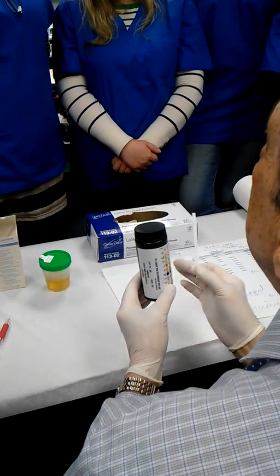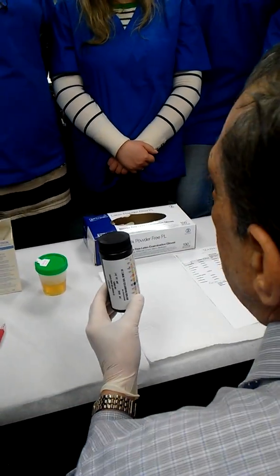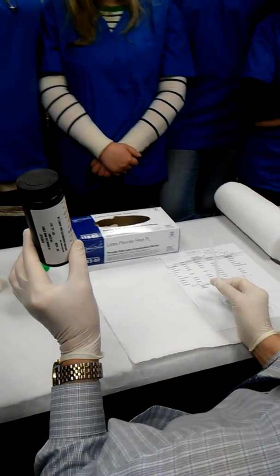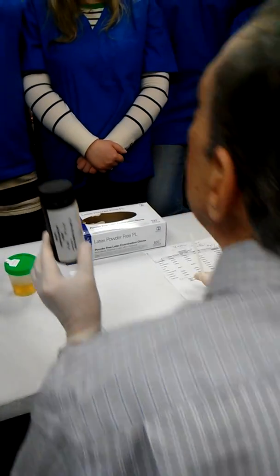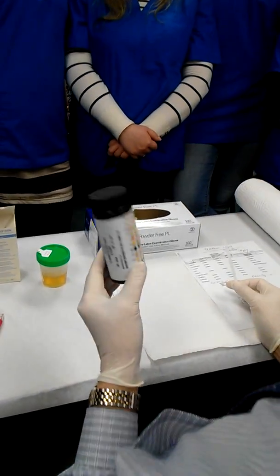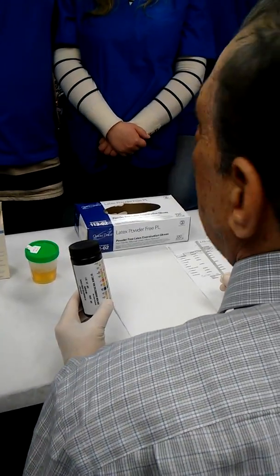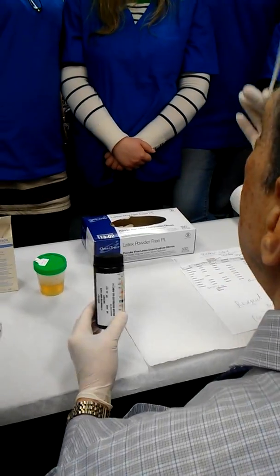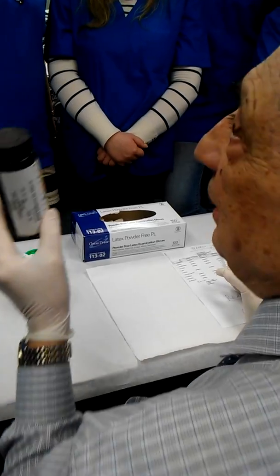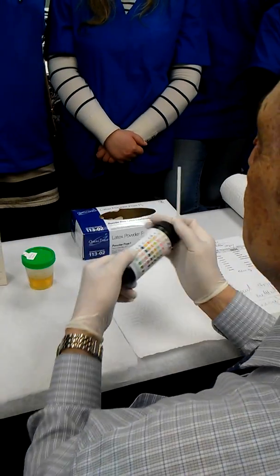For example, if the strips are finished, you have to discard this bottle. You don't have to use it anymore. Okay, clear? То есть соображение сбережения тут неуместно. Мы ничего не сберегаем. Okay? If it's over, you discard it and you use a new bottle with strips and new colors. So what are you doing?